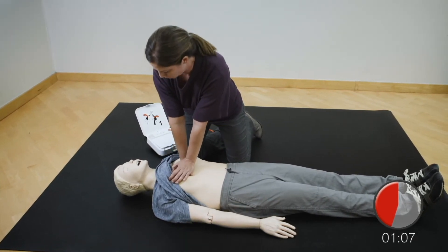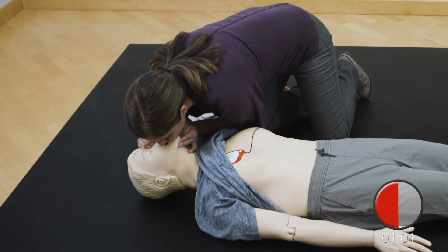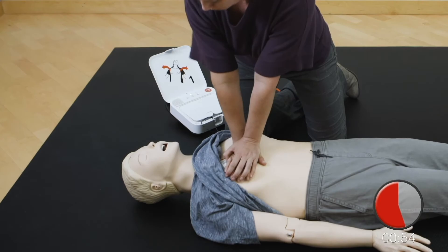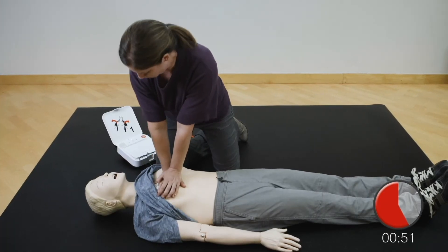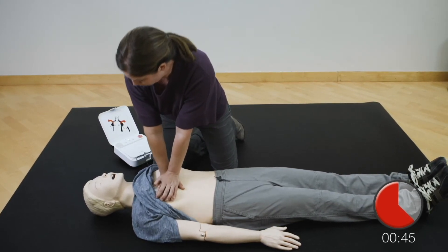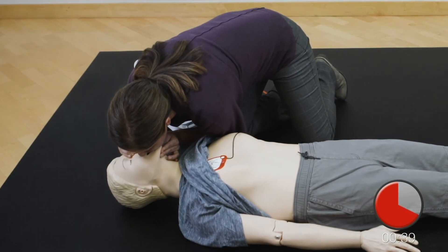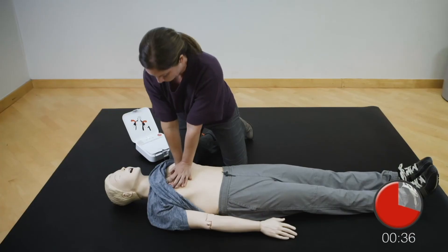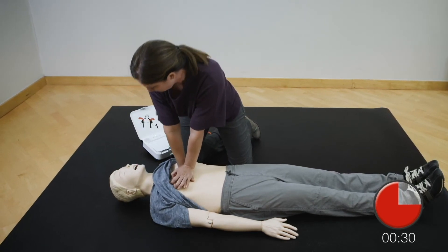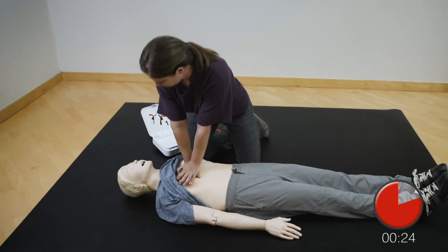Provide two breaths. Resume chest compressions. Push down hard at least two inches. Push down hard at least two inches. Push down hard at least two inches. Provide two breaths.